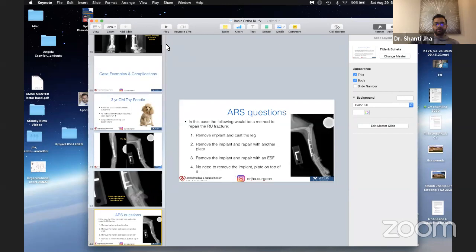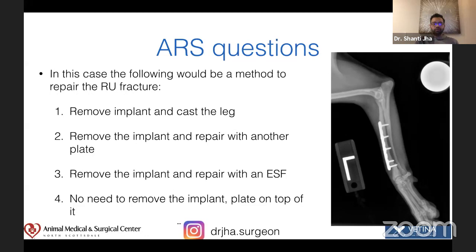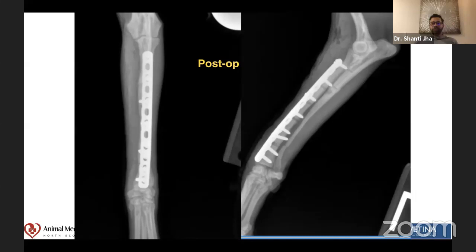Thank you. Okay. So in this question, the most important thing is that we have to remove the implant and repair with another plate. All right. So there is the repair right here. So what are the changes here? And you can see the changes I made.